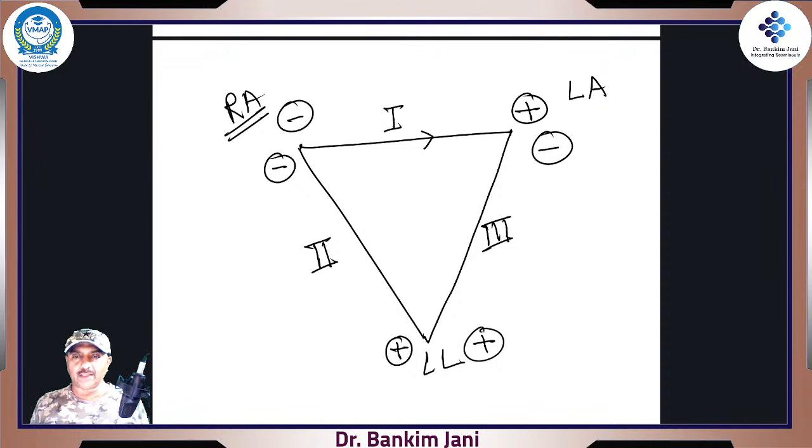So by mistake, no one attaches that left leg electrode onto the right leg, because if that happens, everything would start changing, right? So that's why a dummy electrode is there, so that there is never a mistake. Clearly mentioned right arm, left leg, right leg, and that right leg is not having any electronic connection into the machine. This is what we now draw, right?